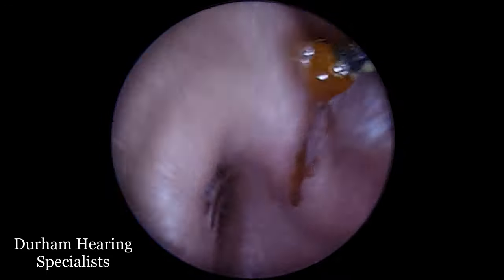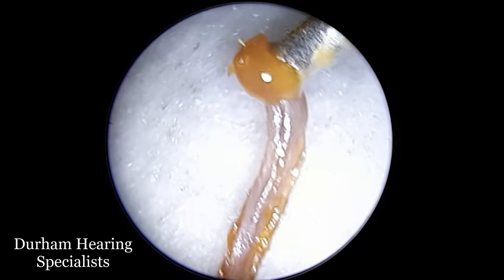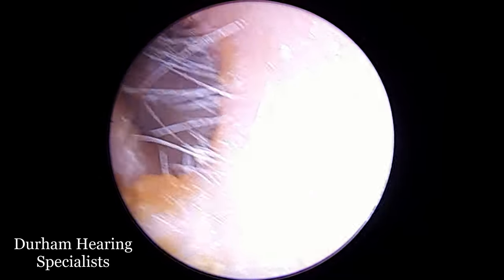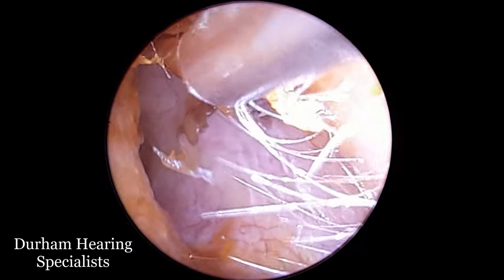Well, that's most of it anyway, and you can see how it's in a long sort of trail — so you could imagine how that was adhered further down in the canal.